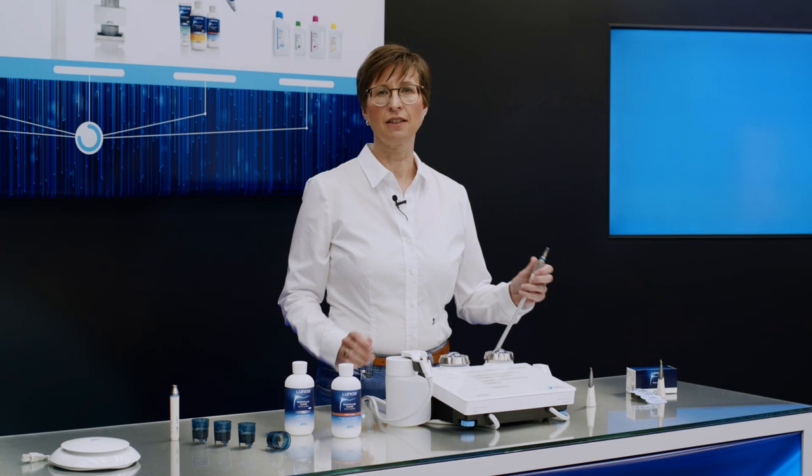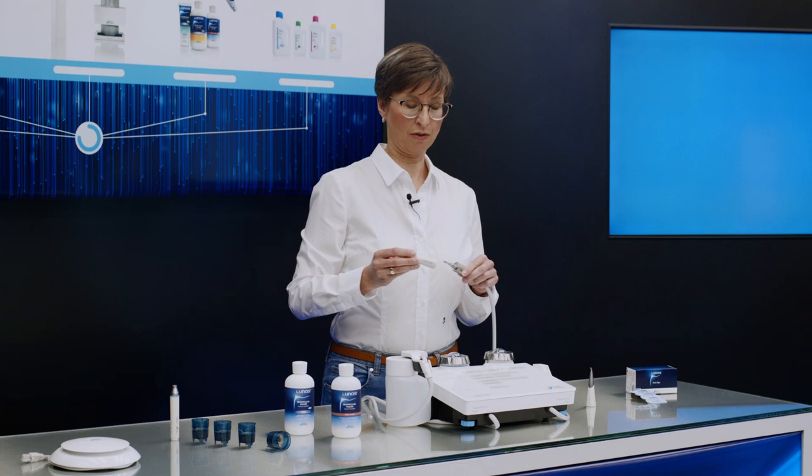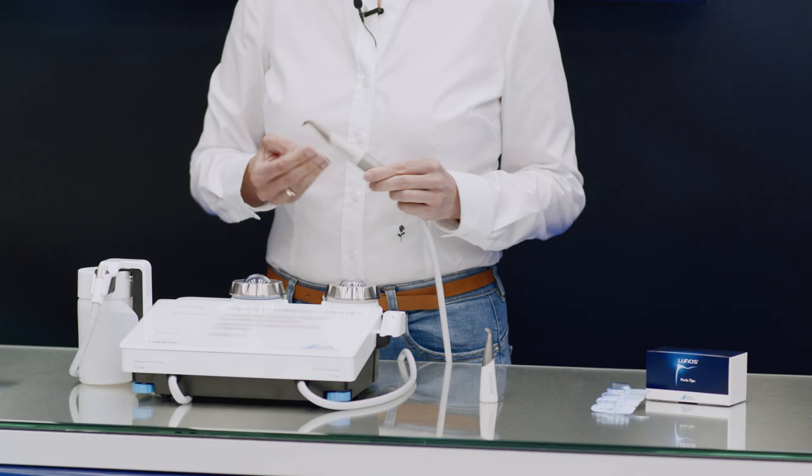The perio nozzle, on the other hand, is used for subgingival applications, such as in periodontitis and peri-implantitis treatments. This is supplemented by the sterile single-use perio tip with depth mark.